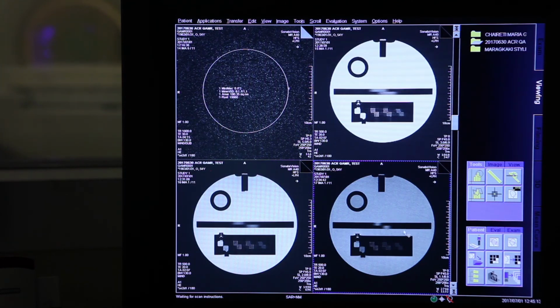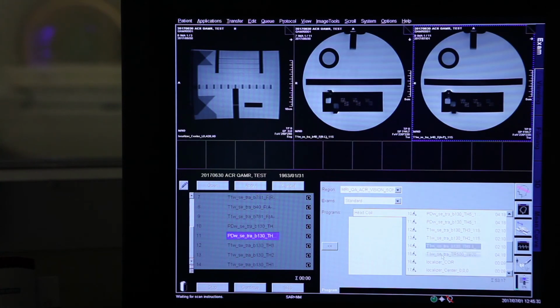They recommend not to go that low. Use it and keep it up to 2mm. If you want to go to lower slices, then you use 3D sequences. Otherwise, you're mixing the problems there. That's what I say. Now there is the last check left, which is called high spatial resolution.